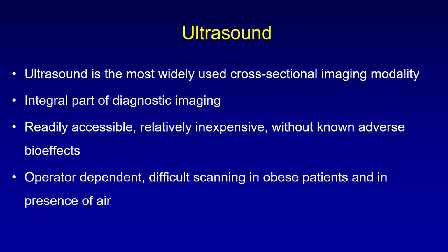Ultrasound is the most widely used cross-sectional imaging modality. It's an integral part of diagnostic imaging. It's readily accessible, relatively inexpensive, without any known adverse bioeffects. Then why do we need another modality? Because there are still gaps. It is operator dependent. There's difficult scanning in obese patients and in the presence of air.